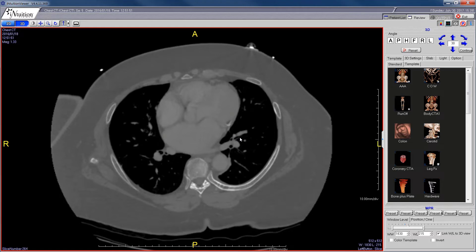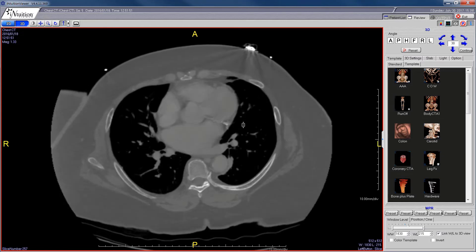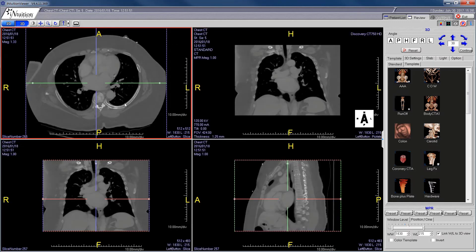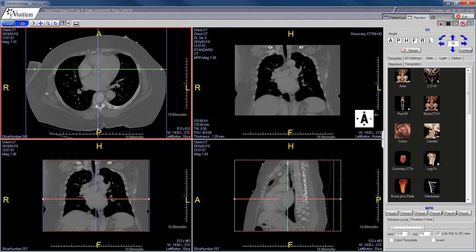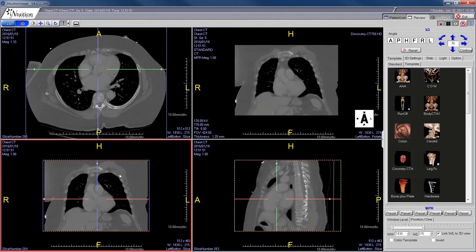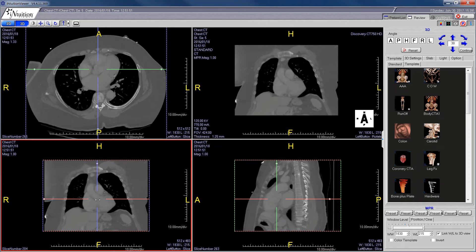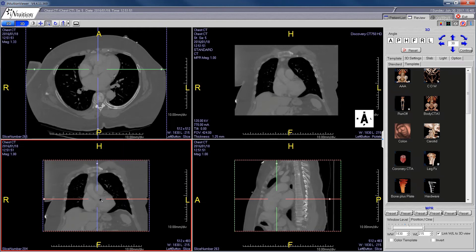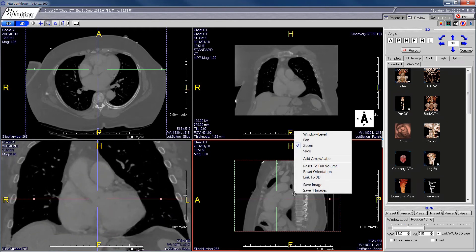If you have a structure you want to view in three different planes, navigate to that structure — for example the aortic valve. Double-click anywhere to make the image small again, then use the crosshairs to move over to the aortic valve, and the other two images will automatically align to that structure. You can then zoom in on any of the planes, including the sagittal plane.